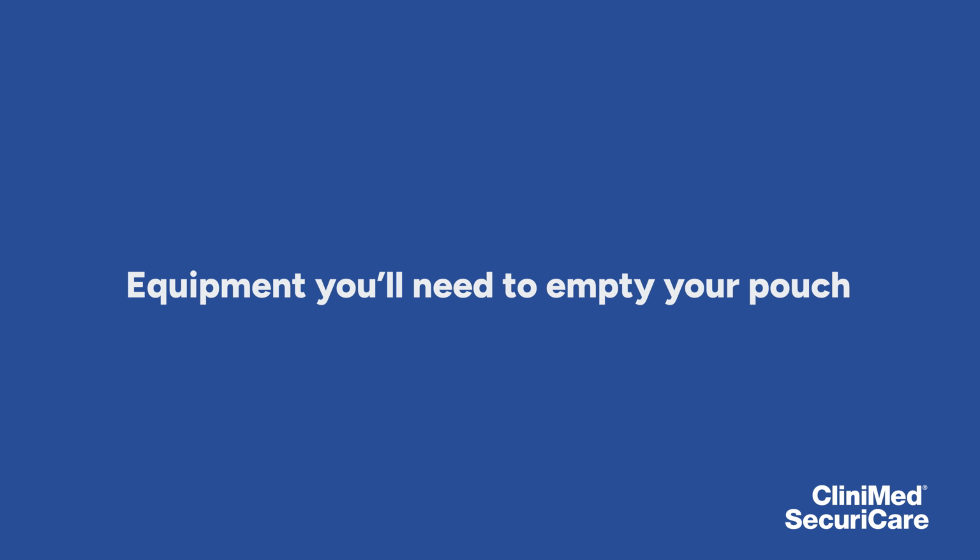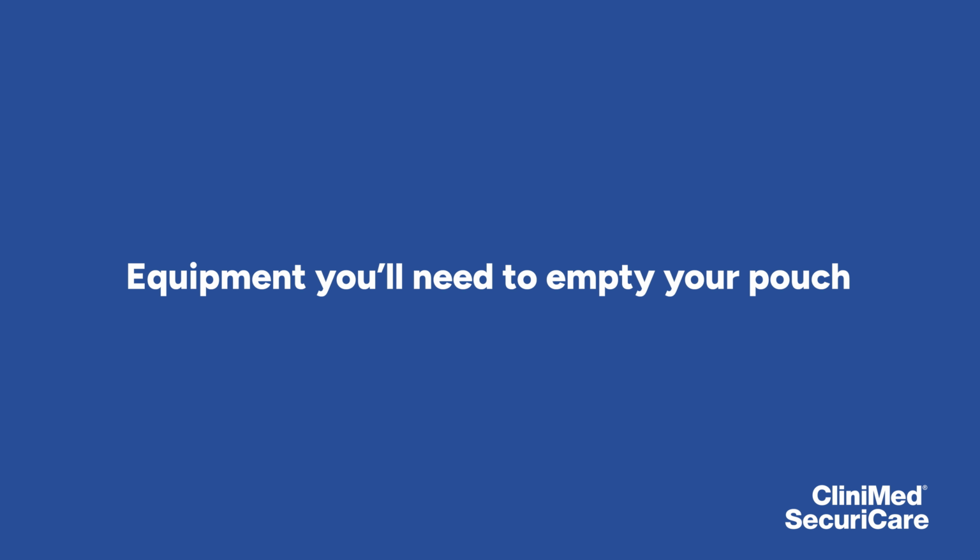You should empty your pouch when it feels bulky or when it's about 1/3 to half full. This applies both during the day and before you change your pouch. All you'll need to empty your pouch is some toilet paper for cleaning the outlet or tap afterwards. And of course, always wash your hands both before and when you're finished.